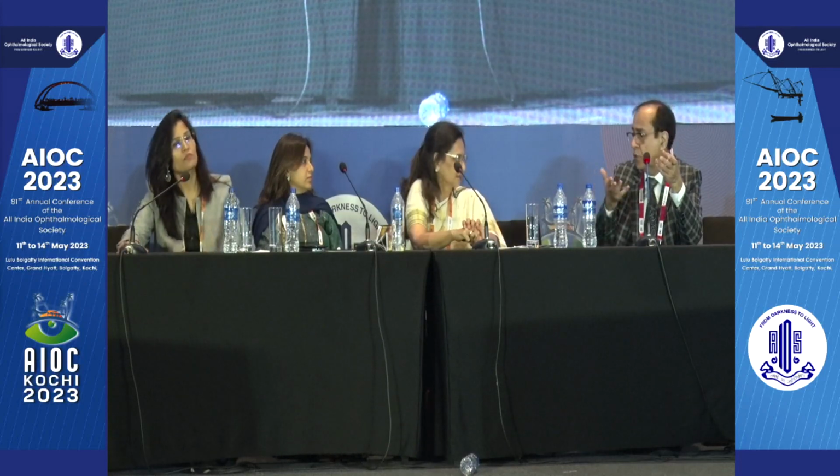See, normally if it is more than 4 clock hours, I think you need to put the CTR. And now CTR is actually very simple to insert. So any patient, even when I operate a hard cataract where the capsule is a little floppy, I put on a CTR because I don't want post-op decentration. Even when you are doing IA, you see the entire capsule is fluttering, I'll put on a CTR. So CTR gives a very good strength. So this is a good idea to put on a CTR. It's better to put on a CTR than not to put it, whatever may be the clock hour.